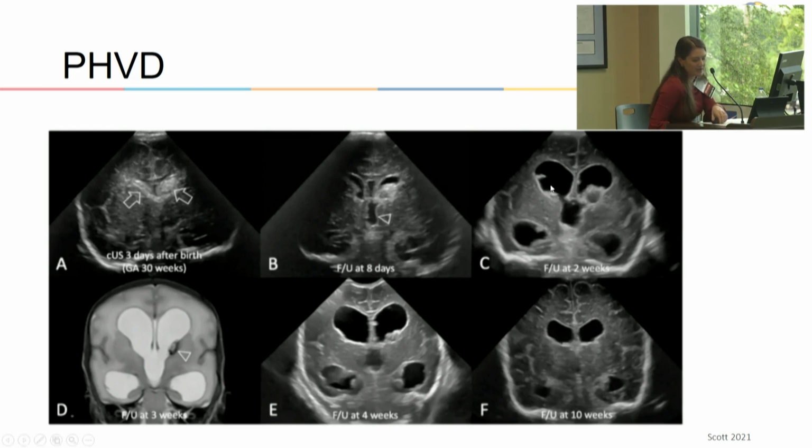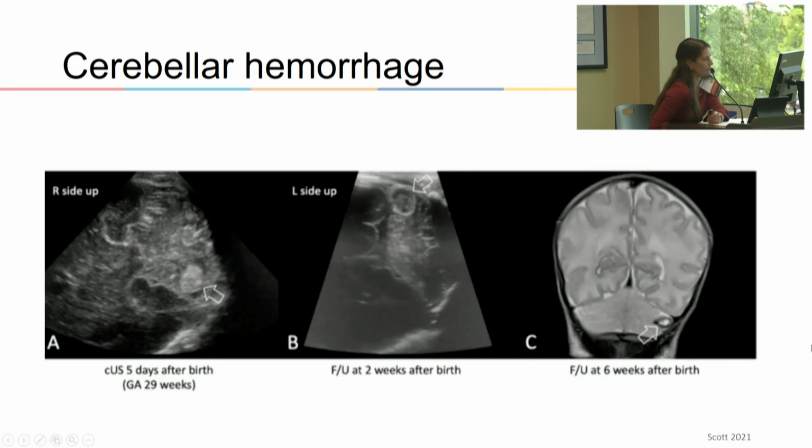And usually it happens relatively quickly after IVH, but that's why we do serial head ultrasounds after a baby has been found to have IVH, in order to pick up on this early and do appropriate interventions as needed, but they can resolve without intervention. So you can see this baby at 4 weeks had some obvious ventricular dilatation with that rounded shape of the ventricle, echogenic ependyma there, and then had resolution. So they can resolve on their own.